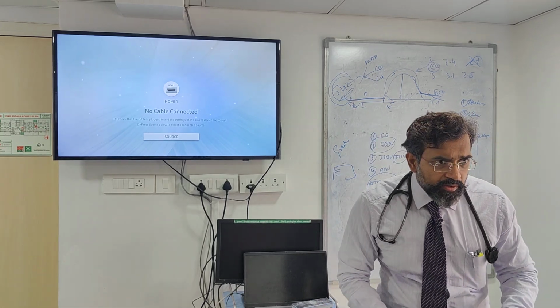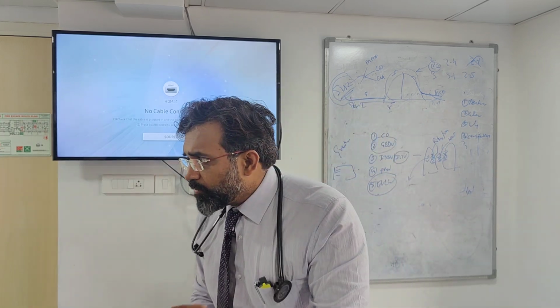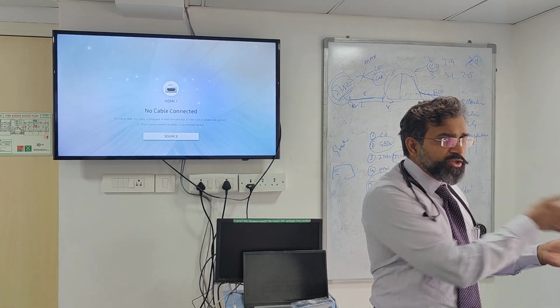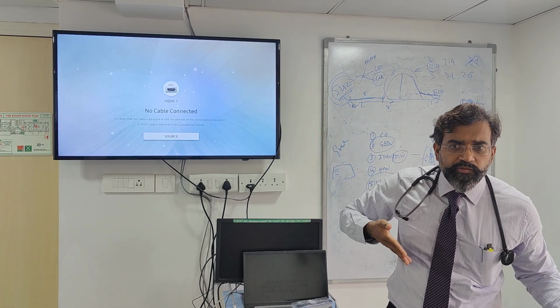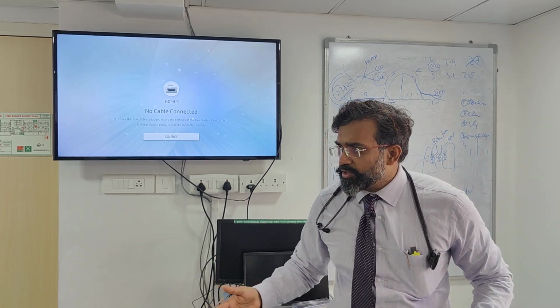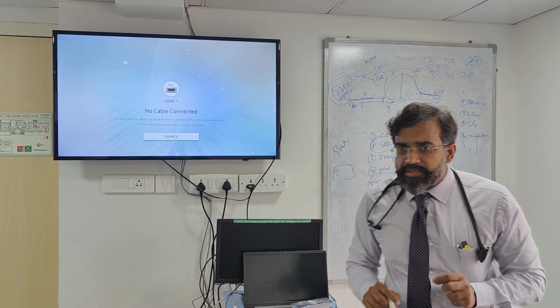I still look at it. It's not that I won't look at it. But you understand the fallacy with SVR? Because it depends on the CVP, it actually depends on where your CVP is lying. Is it lying near the pericardial reflection? Is it lying in the ventricle? Where is it lying? So that's a problem. That's why you should be careful when you're interpreting your SVR.